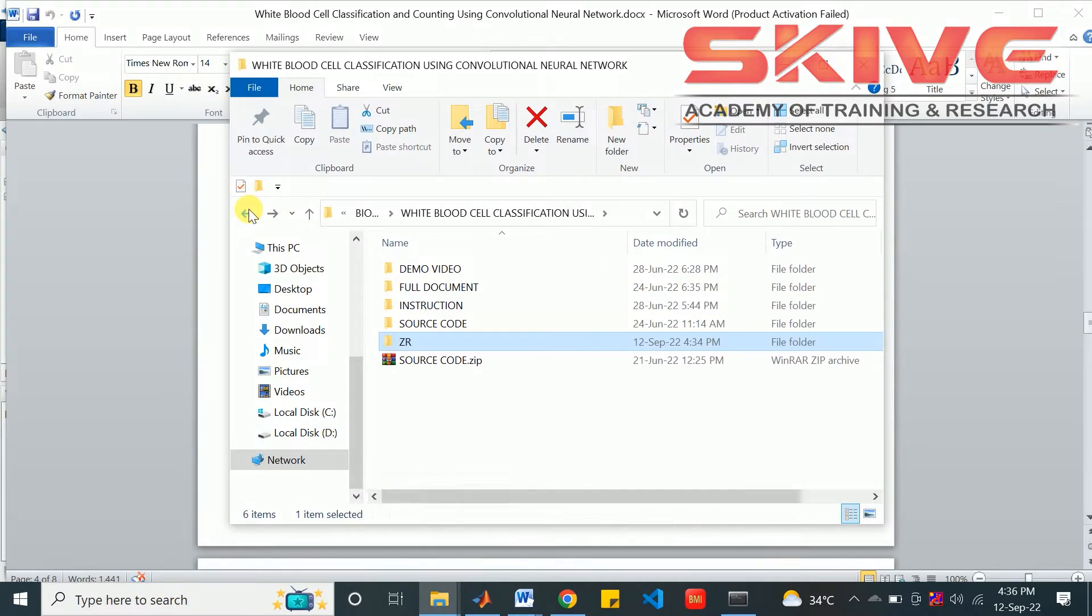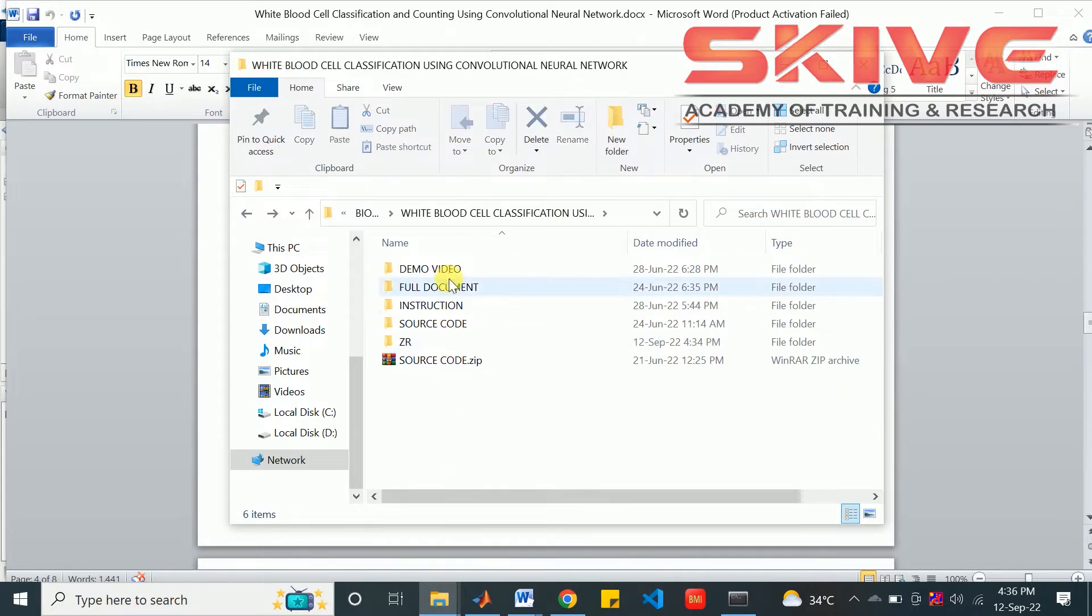Hello! This project is about white blood cell classification using convolutional neural network. These are the materials we are providing with the project.